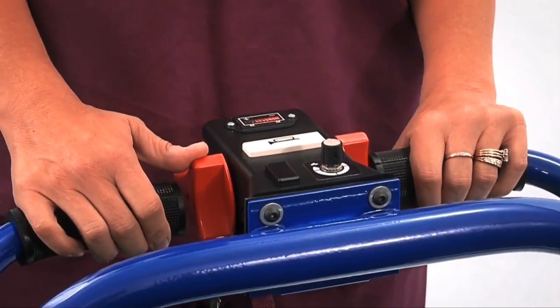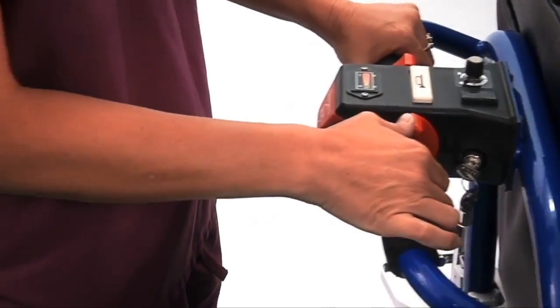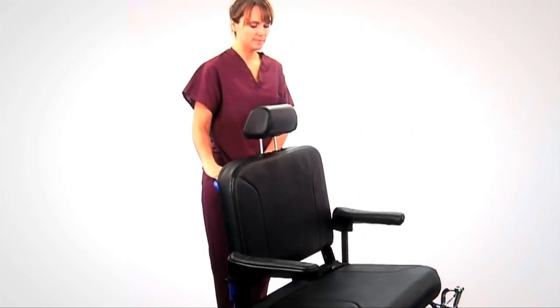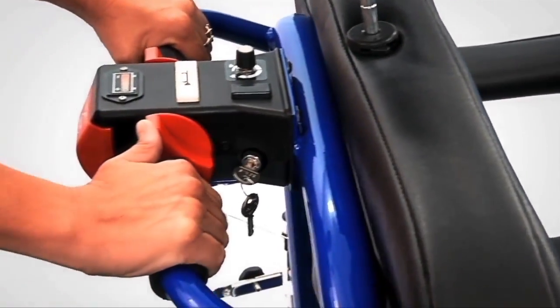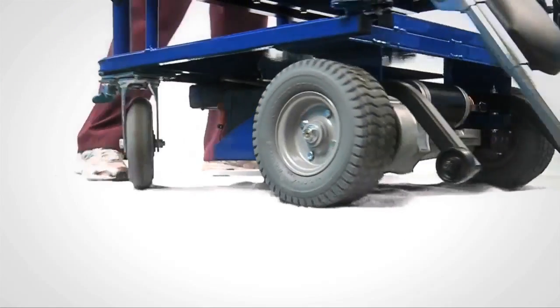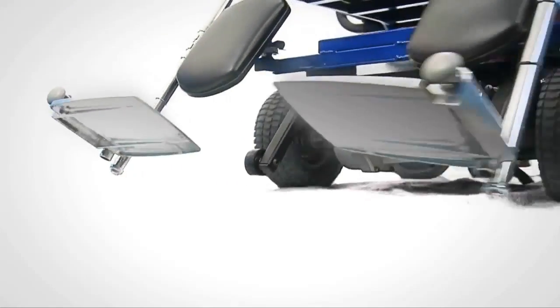The further you push the control, the faster the Breeze will go, similar to a car. Steer the Breeze the same way you would a manual wheelchair. To stop, remove your thumb from the accelerator. The Breeze will come to a complete stop. The Breeze can also be moved manually without the power drive.